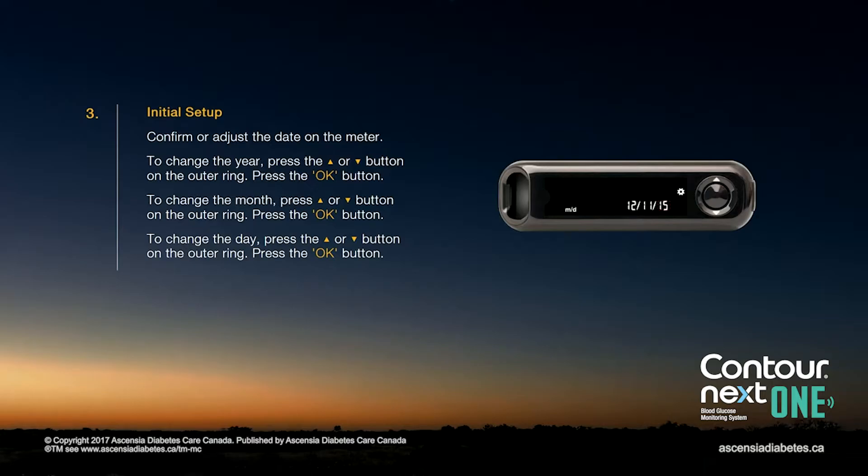Confirm or adjust the date on the meter. To change the day, month, or year, press the up or down arrow button on the outer ring, then press the OK button to confirm each value and advance to the next.